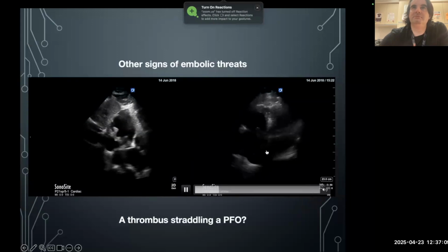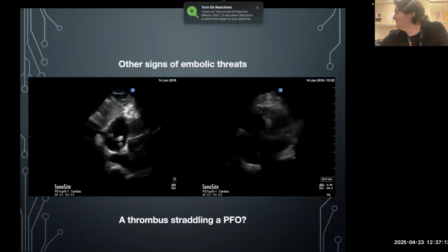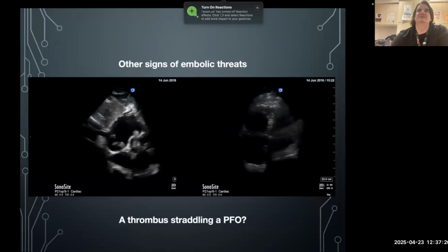The most clots in transit I've seen are actually picked up incidentally, mostly by ER docs. Oh, interesting. Yeah, because they're the ones who are undifferentiated, almost going on, look at the heart, and they catch it. Yeah. Which is good for them.